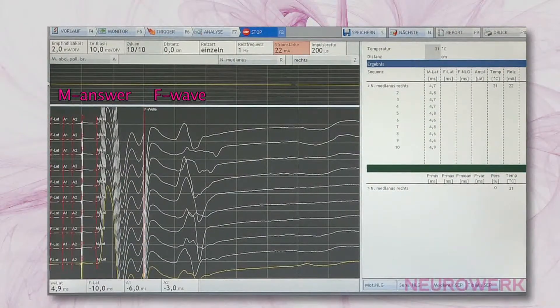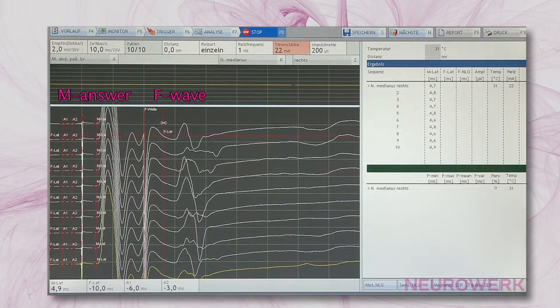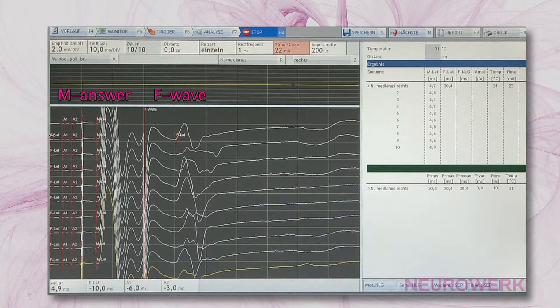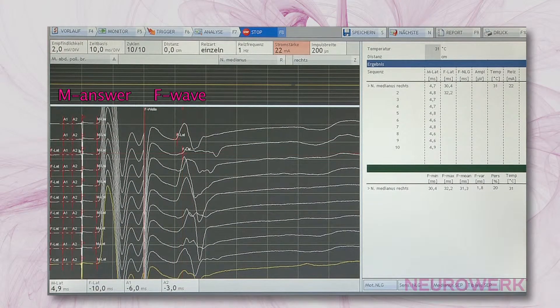Following this, the latency cursors of the F-Waves are placed. The amplitude markers are set on the highest negative and highest positive peaks.